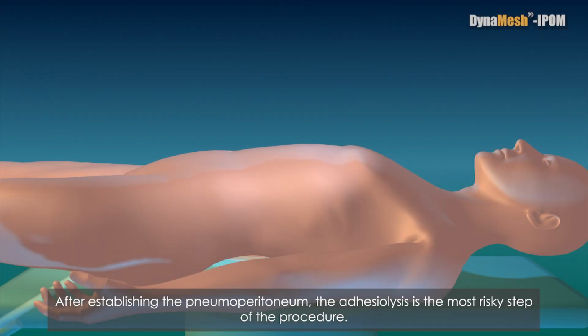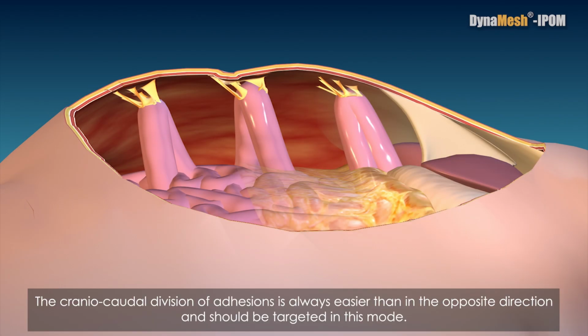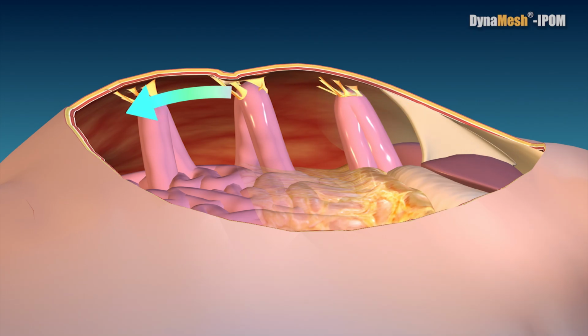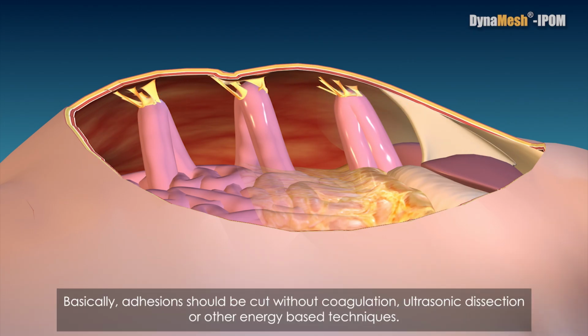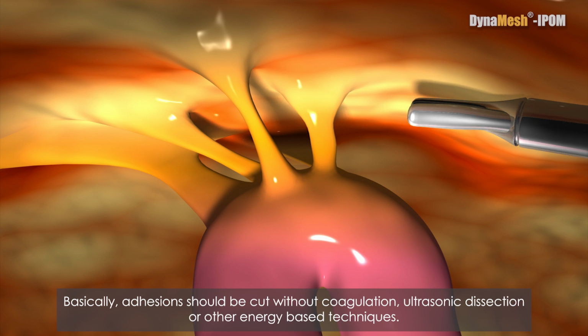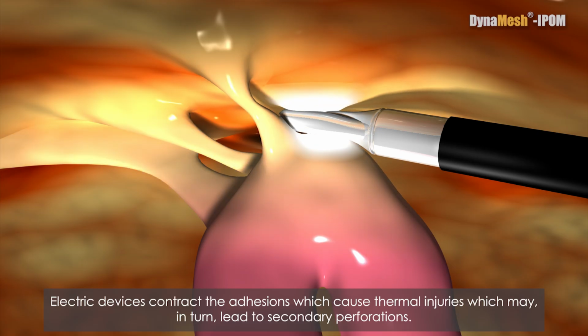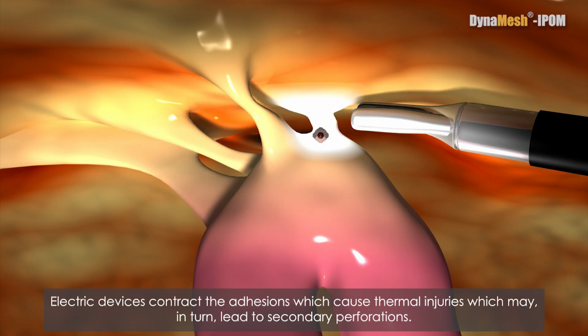After establishing the pneumoperitoneum, the adhesiolysis is the most risky step of the procedure. The craniocaudal division of adhesions is always easier than in the opposite direction and should be targeted in this mode. Basically, adhesions should be cut without coagulation, ultrasonic dissection, or other energy-based techniques. Electric devices contract the adhesions, which cause thermal injuries, which may in turn lead to secondary perforations.